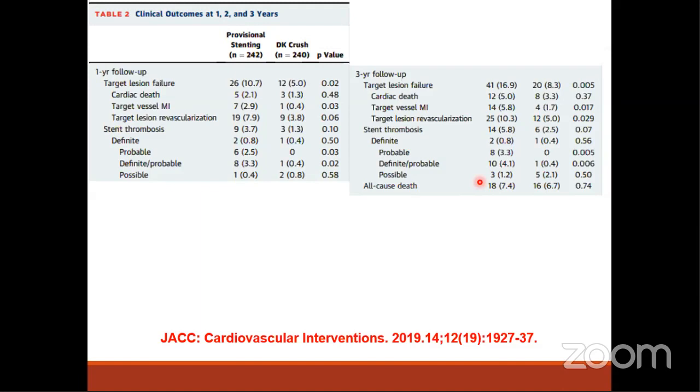It is logic. The final and important comment raised by you and by Dr. Zahran and by Dr. Samir: wire recrossing in all bifurcation stent occur as a distal stent struts, except with crush. It is from the proximal or the middle, and the longer the crushed stent, the more space you can go into the side branch to be the middle, and the shorter the crushed stent, the necessity for your wire to be at the most proximal strut of the stent. Thank you, Karim, for this important presentation.